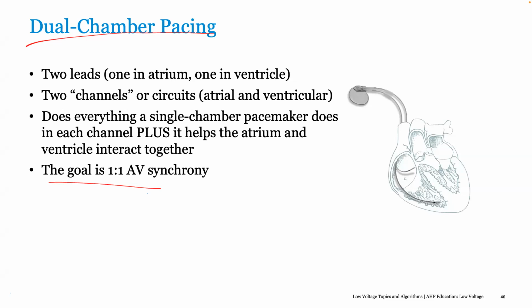And given the other population you face down there is your chronic AF patients with slow ventricular response, again, just a very basic VVI pacemaker is suitable for these patients as well. Again, you don't need anything too fancy.